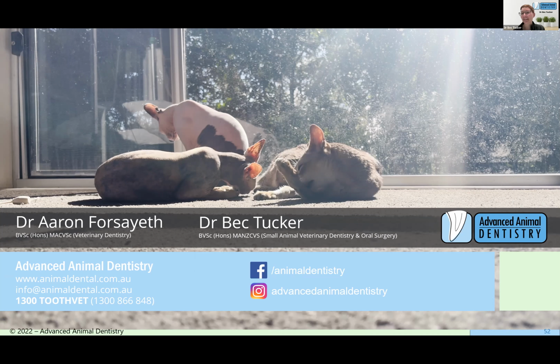And we did find that the plate wanted to walk around a lot more in the patient's mouth. I guess because it does want to naturally close more, it doesn't want to stay propped open. So you have that essential scissors-like closing over it, so it wants to really flip it around. The other thing that we find in lateral recumbency is that their mouth will often stay propped open a little bit easier, and you can more specifically get the plate into position and it'll stay there.